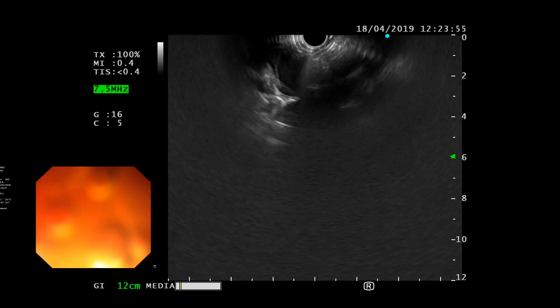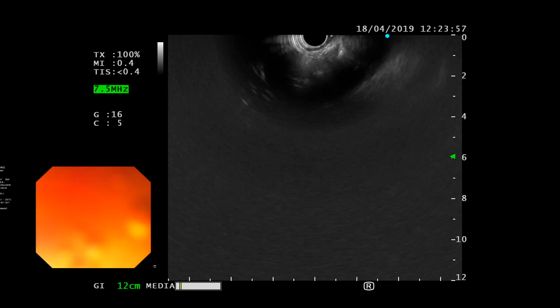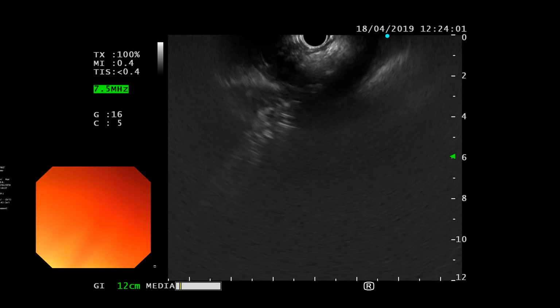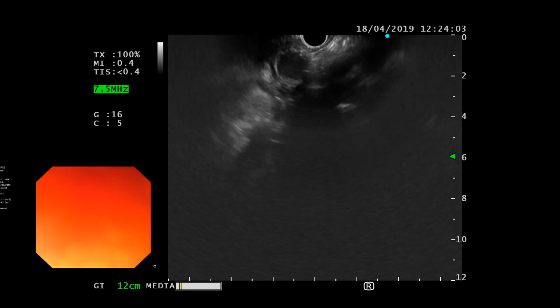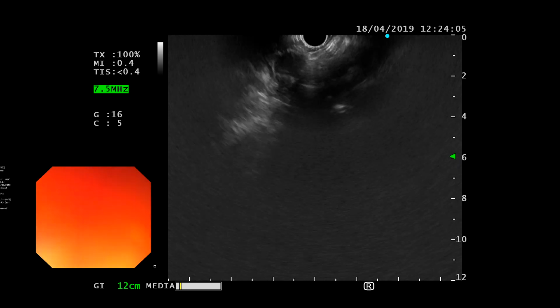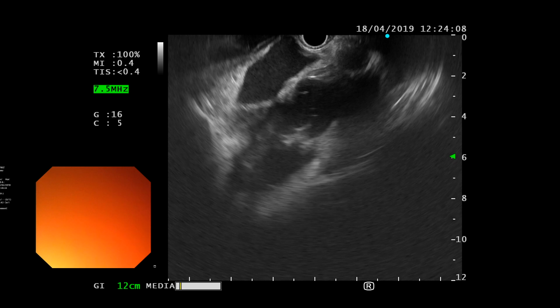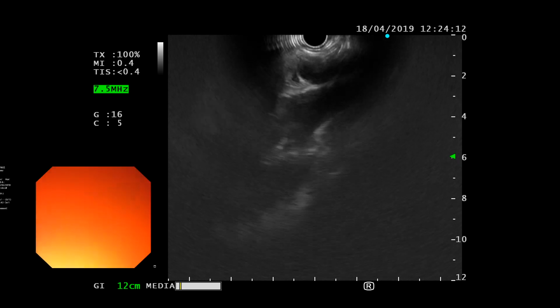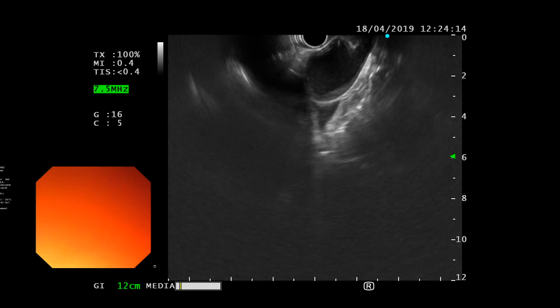Then down, you see there's a little lymph node. Yeah, so Khalid's technique actually was really nice. I don't do it that way, but you can certainly do it that way. I usually follow the aorta. Once I have the aorta in view, I just pull back. Okay, that is the more bookish way. Yeah, that I have read in the book.